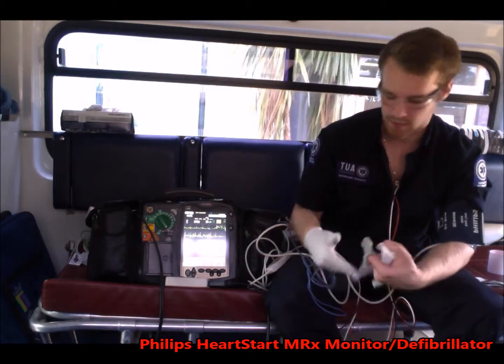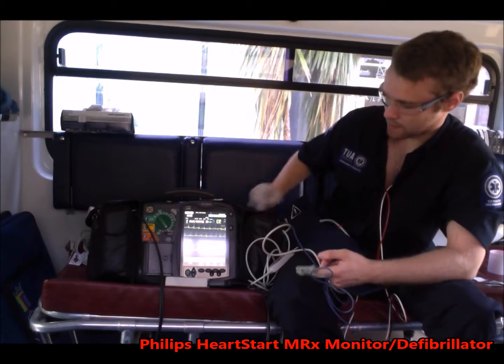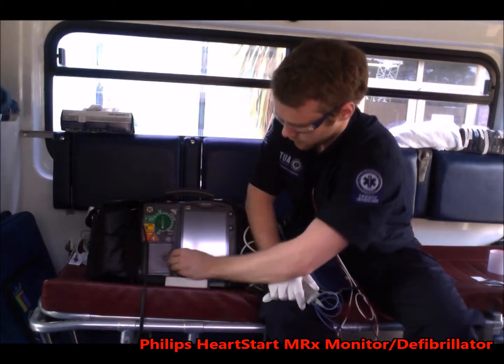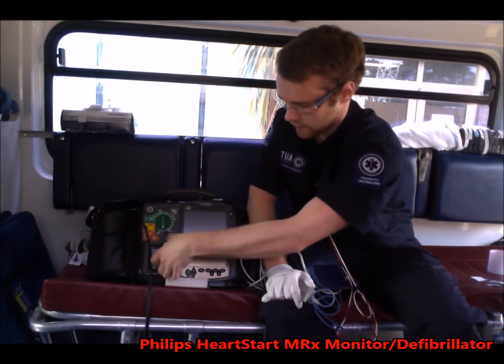And that can detect your SpO2 right over here. Lastly, if we wanted to change the ECG paper, we would turn it off and pull this latch back so this pops out, and then we have our ECG paper.